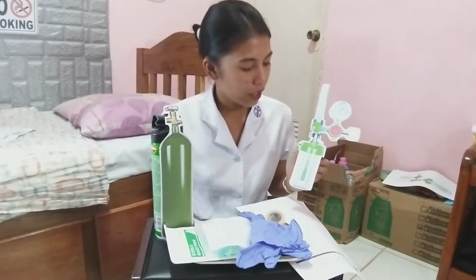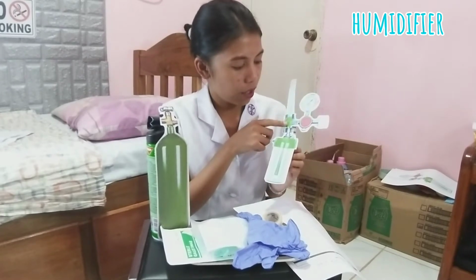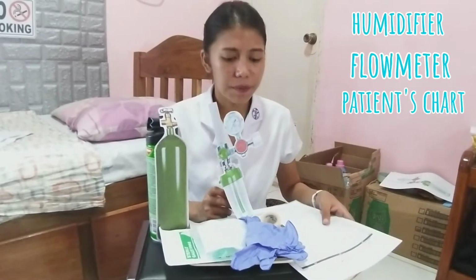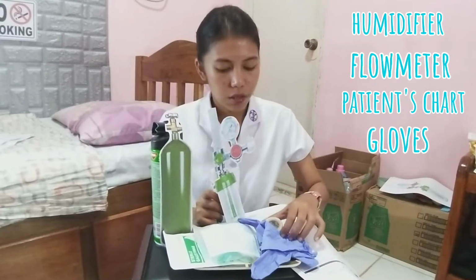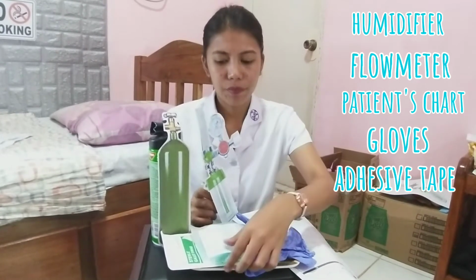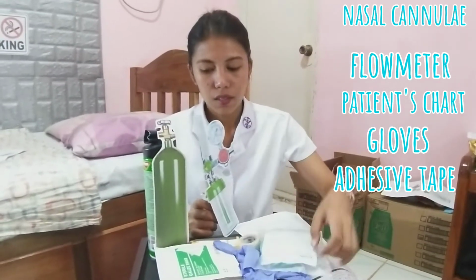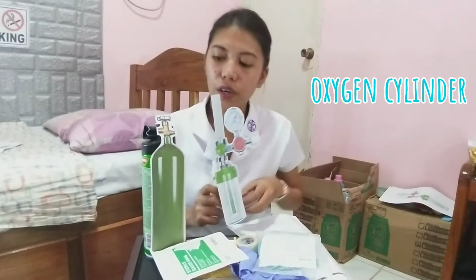We have here the humidifier, as well as the flow meter, the patient charts or the record, gloves, adhesive tape, the nasal oxygen cannula, sterile gauze, and our oxygen cylinder.